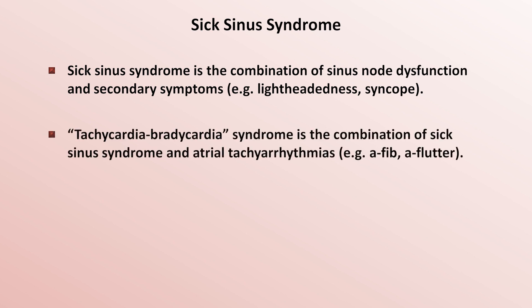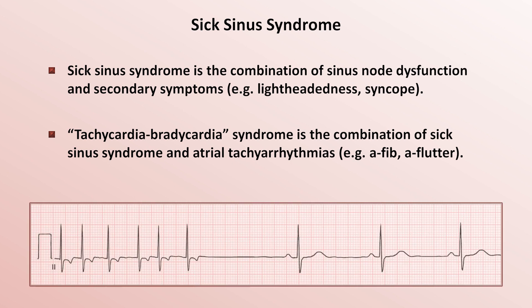The tachybrady syndrome is the combination of sick sinus syndrome and atrial tachyarrhythmias, usually AFib or AFlutter. Here's a great instructional rhythm strip from someone with the tachybrady syndrome. The first 6 beats are part of a rapid, irregularly irregular, narrow complex tachycardia without discernible P waves — so almost certainly AFib. Then the patient spontaneously converts out of AFib, followed by a pause of about 2 seconds while the dysfunctional sinus node wakes up, followed by a sinus bradycardia at about 45 beats per minute. This is classic tachybrady.